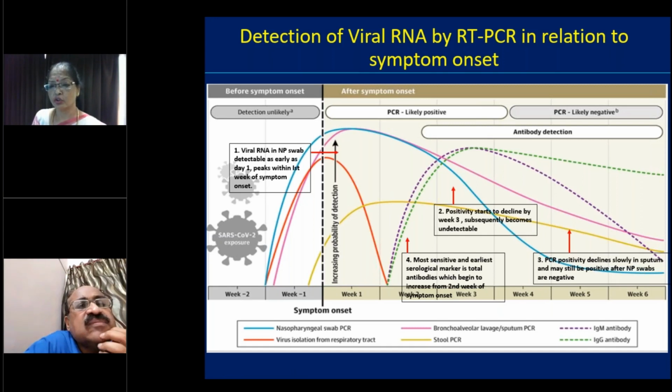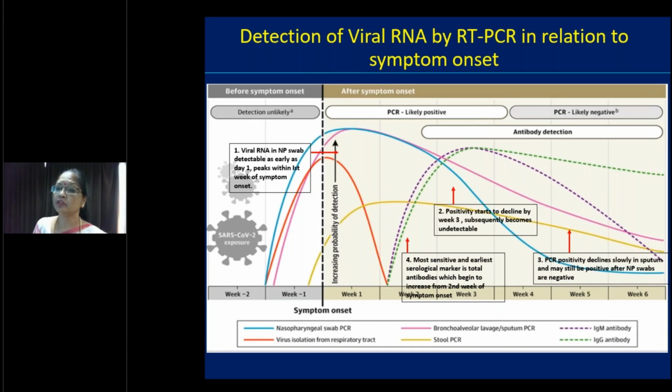Regarding the serologic and other testing, its correlation with other testing like antigen detection tests and antibody tests, Dr. Sangram will tell you. But briefly, this antigen detection test, you have to do this test.